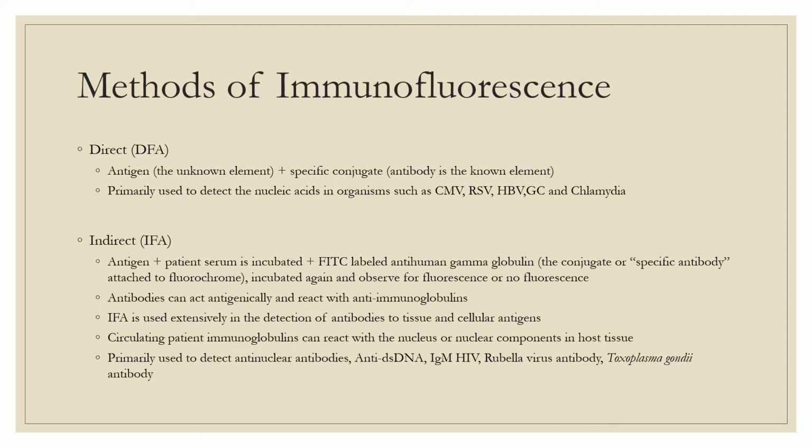In the direct fluorescent antibody technique, also known as the DFA, a conjugated antibody is used to detect antigen-antibody reactions at a microscopic level. DFA can be applied to tissue sections or in smears for microorganisms. In addition, clinical immunophenotyping is done through direct fluorescent assays.